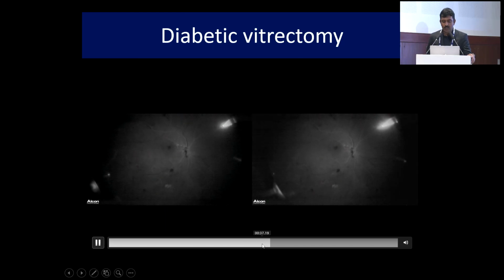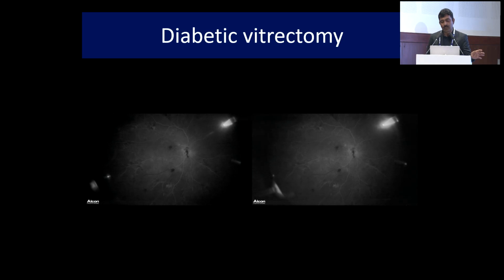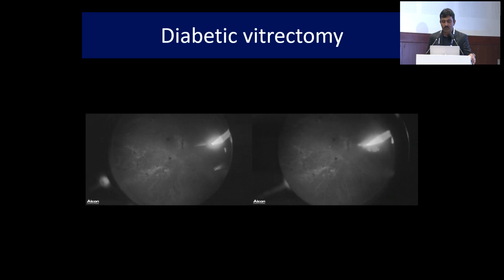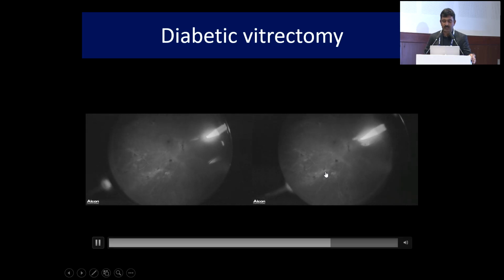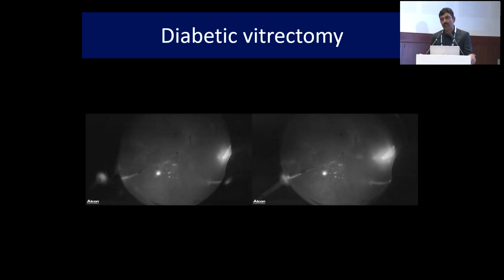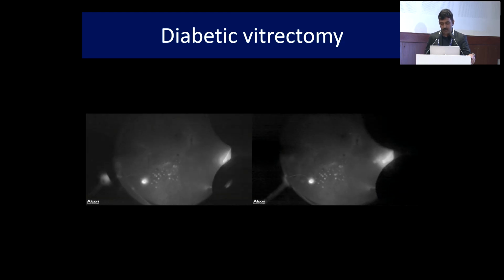Once you inject the fluorescein, you can clearly see the filling of the arteries and the veins, and you can identify the areas of capillary non-perfusion, which are the targeted abnormal areas, and any fronts of neovascularization, where exactly to do a laser. So in this area, there is maximum leakage, so you can do a targeted laser or a targeted PRP to that area. It will add value to the existing visualizing system on how to treat it, and excessive laser and other things can be avoided.